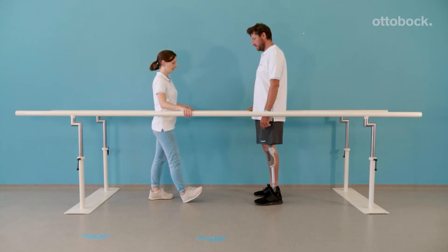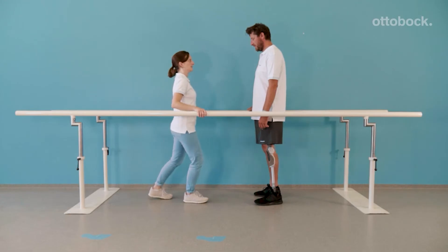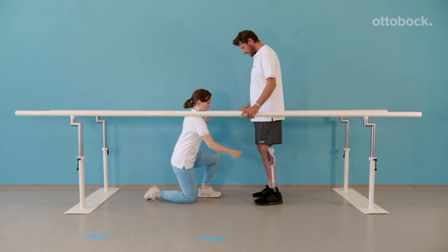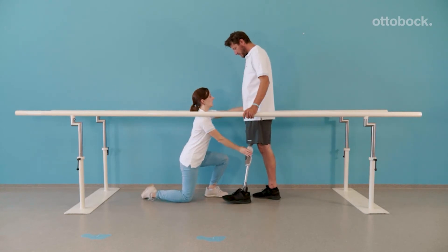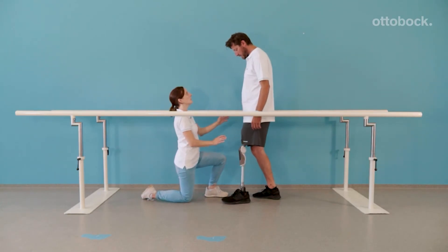Building the trust to put full weight on a flexing knee joint is a fundamental step for handling different situations of everyday life, for example, walking downhill. The model feels resistance against knee flexion and lets the knee joint yield as he applies weight and consistently rolls over the foot.